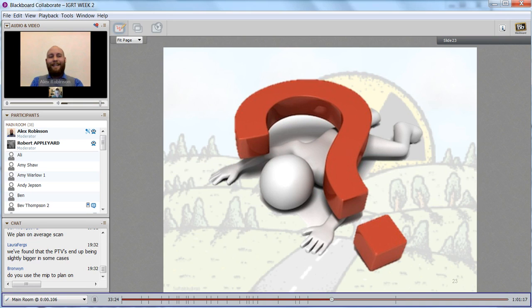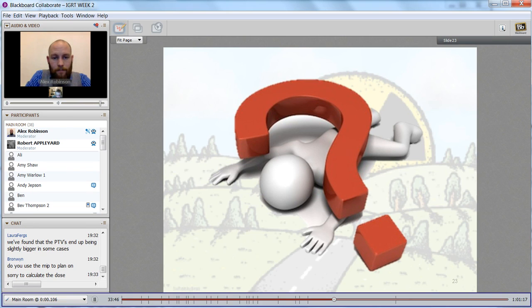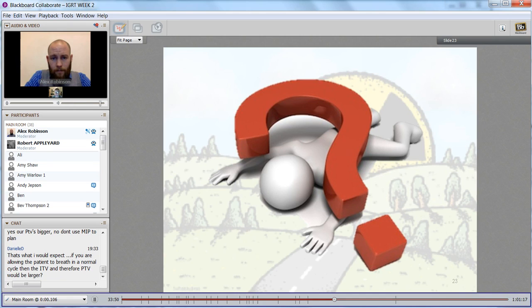Yeah, so it is an option. As a pre-treatment radiographer, it would have made my life, and essentially at the start we did, made my life a lot easier, because you're forcing the patient to get these very dominant peaks and then very dominant troughs. So when we're looking at these peaks and troughs, if we get the patient coached, essentially that is what we get.